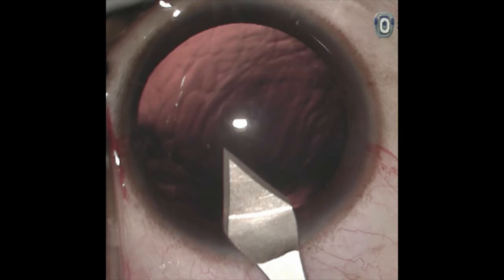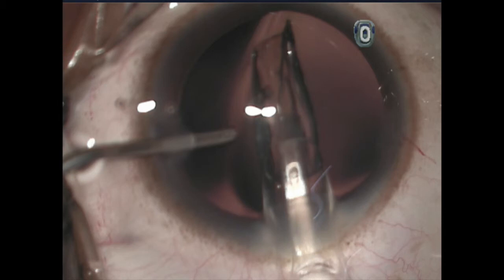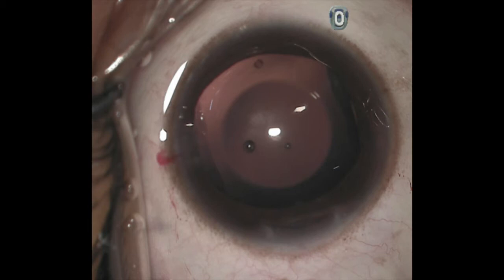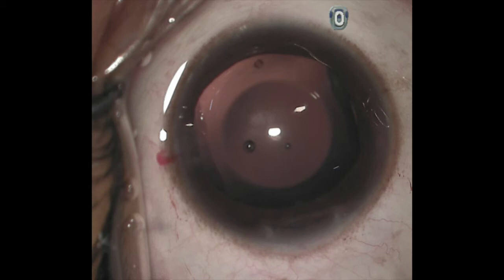A 3.2 millimeter incision is fashioned. Through this incision, the lens — which has been folded in the cartridge — is introduced. As the lens comes out, it slowly undergoes unfolding and sits in the front portion of the eye. With gentle manipulation, the lens is then pushed behind the iris, and the surgery is finished.